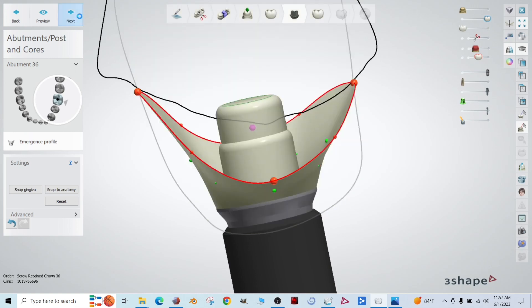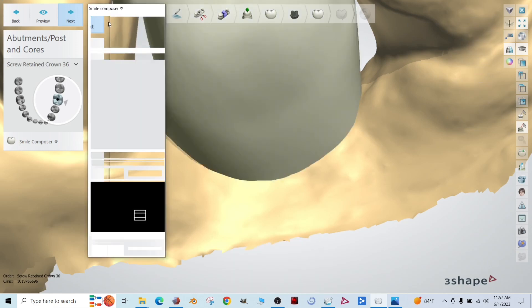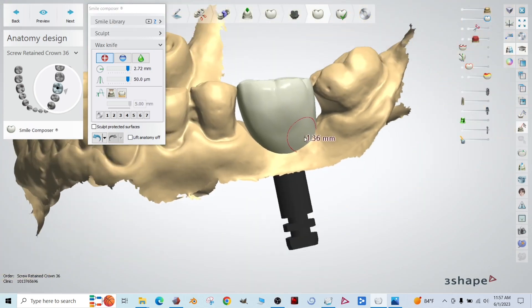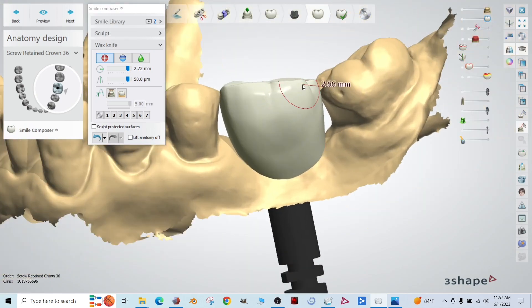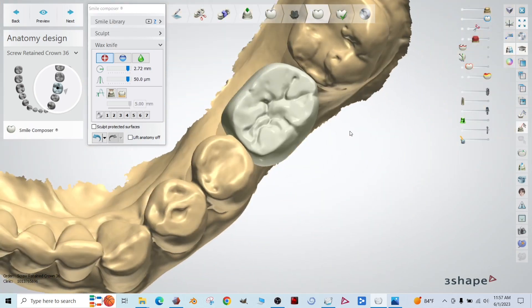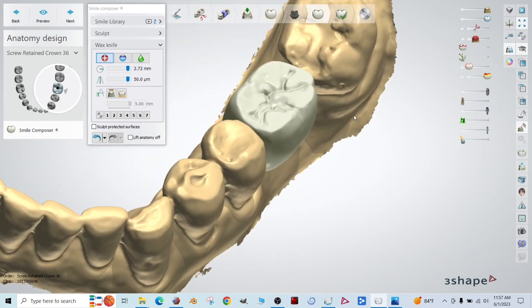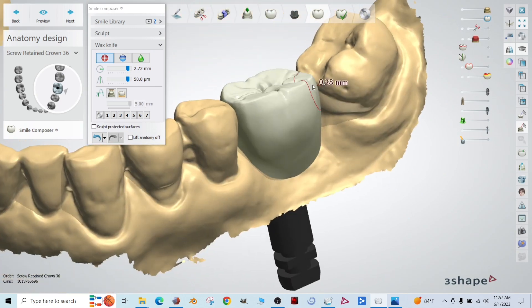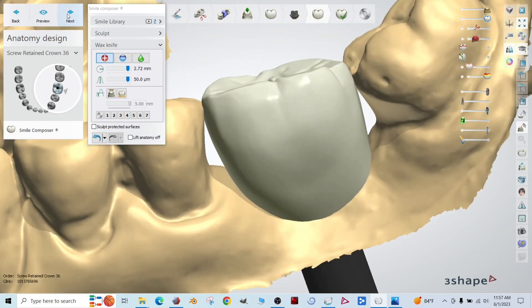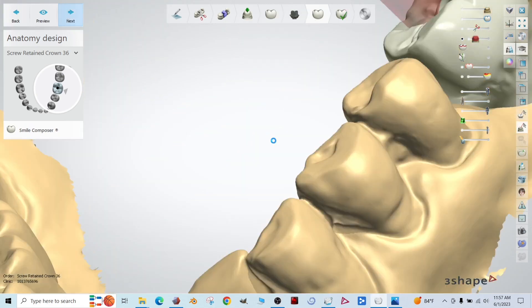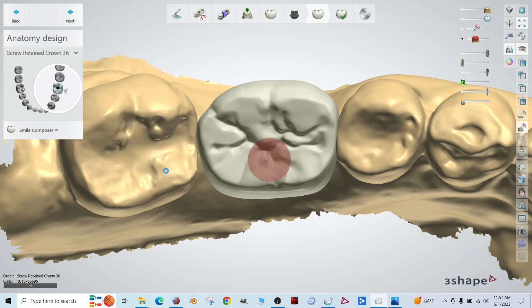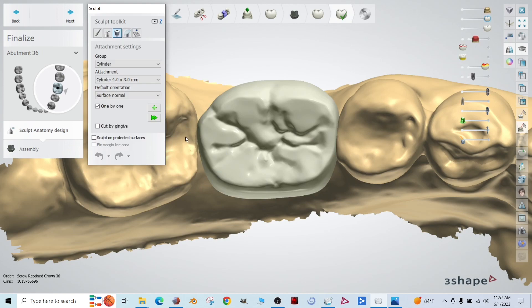All right. We'll go to the next step. This is where you get to do any final touch-ups to your crown. We did most of those a few steps back. The step right before the emergence profile, so we won't need to do anything here. Click next. And yes to this minimum thickness. Click yes to all. Nice.